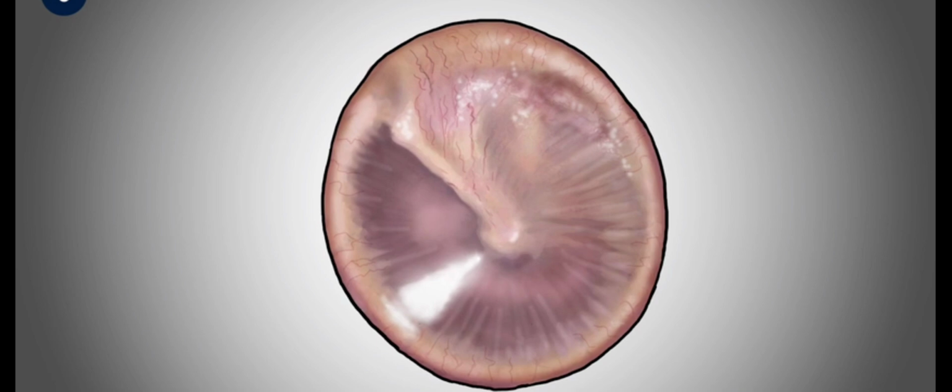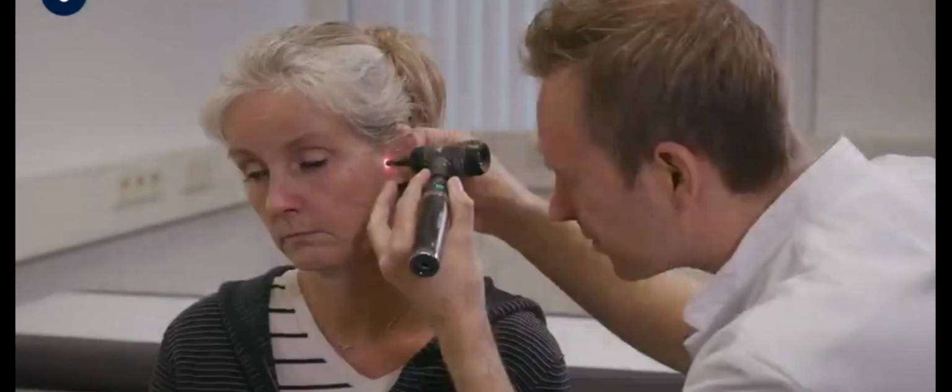The examiner can also look for a light reflex. In a healthy ear, a cone-shaped reflection of light should be visible in the anterior-inferior quadrant. In the left ear, this is between approximately the 7 and 8 o'clock position. Otoscopy is performed in both ears, comparing one side with the other. In this film, just the left is shown.